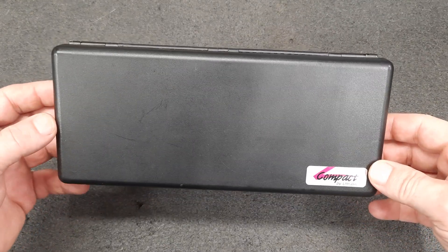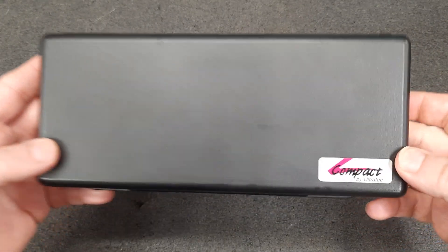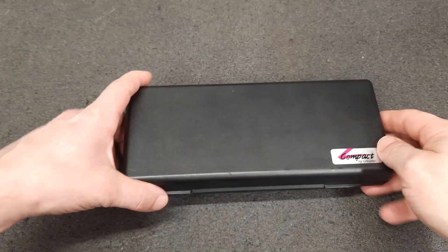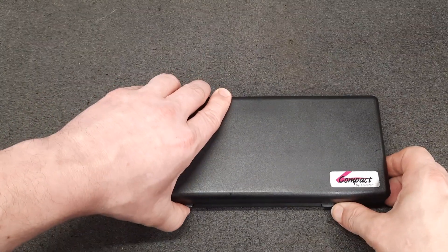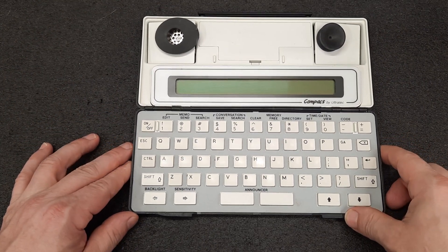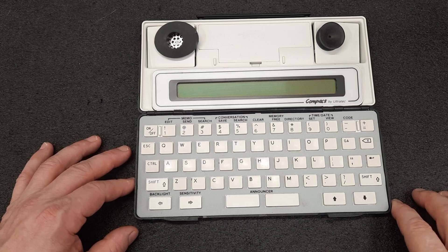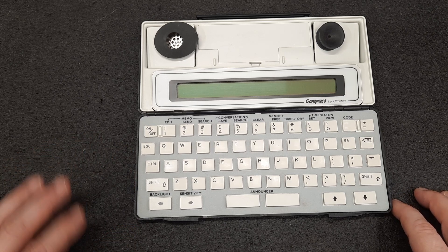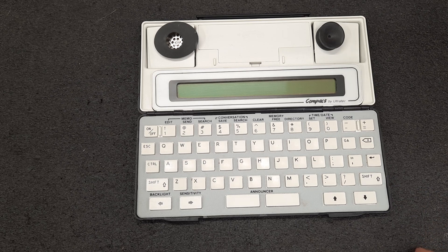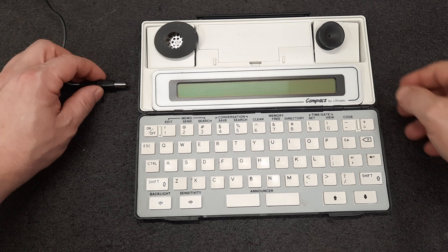Hello everyone, I found something cool from the late 90s - this is an Ultra Tech compact teletype machine, or TTY, for use by hearing impaired people. I was trying to figure out a way to test this thing, and I ran across a forum where they said to record your audio with a cell phone and play it back.